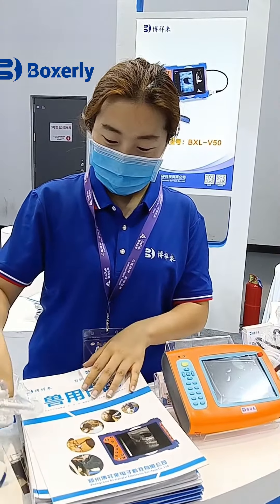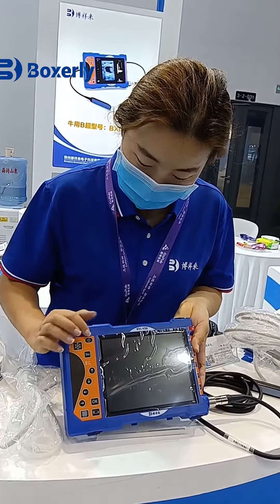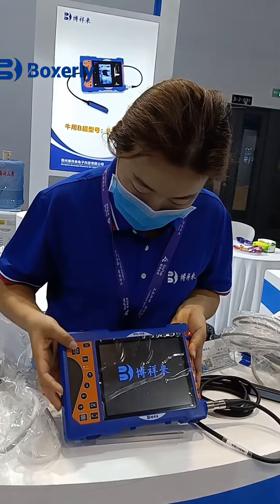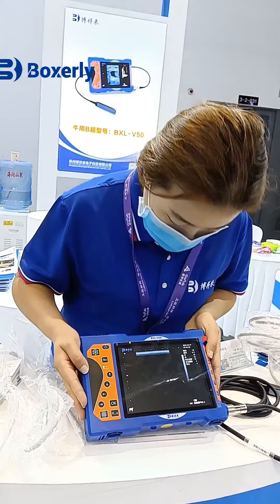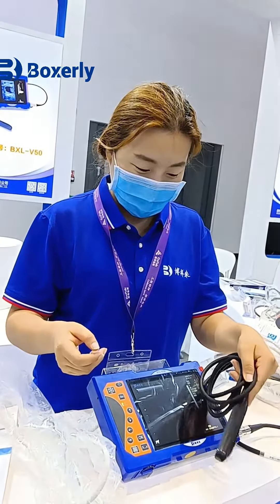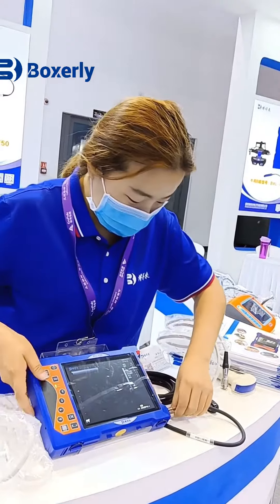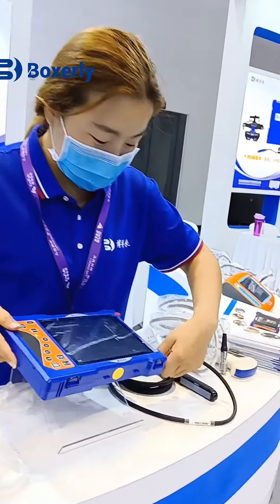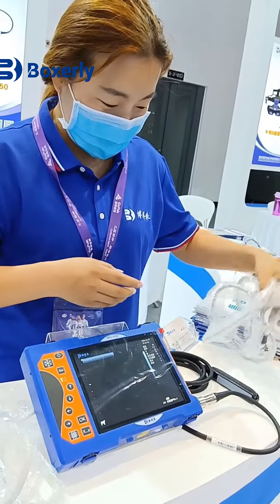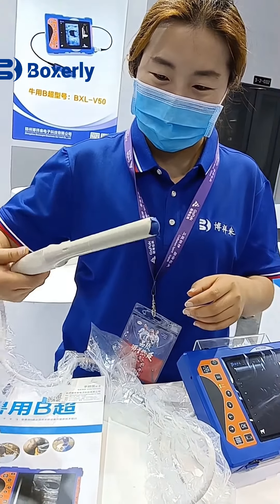This is our second machine, BXLV50, and it is also the product with the highest sales volume. There are buttons on the left and right sides of this machine, which is convenient for both left and right hands to operate. The whole machine is waterproof and dustproof. In addition to the basic pregnancy test, this machine can also check various uterine diseases. It can also be equipped with a rectal probe for sheep, which is convenient for in vivo testing of sheep, and the test results are more accurate.